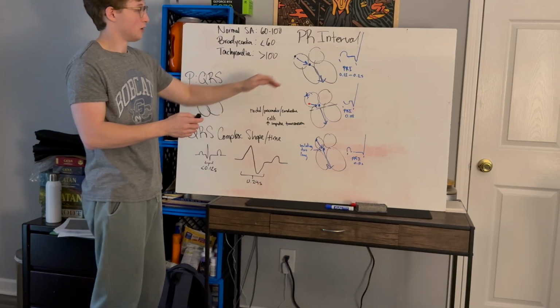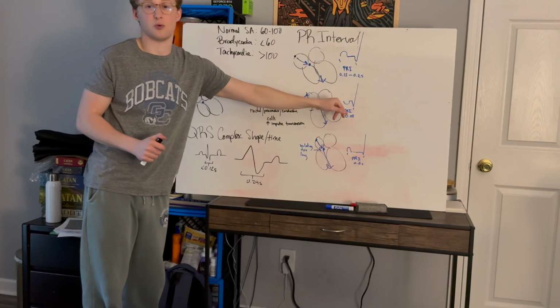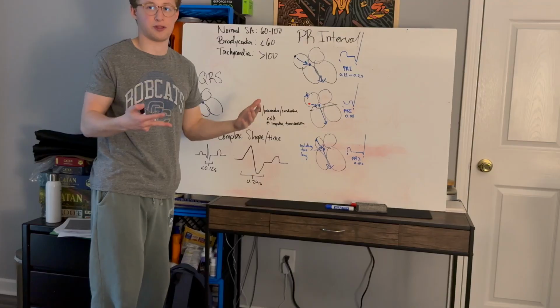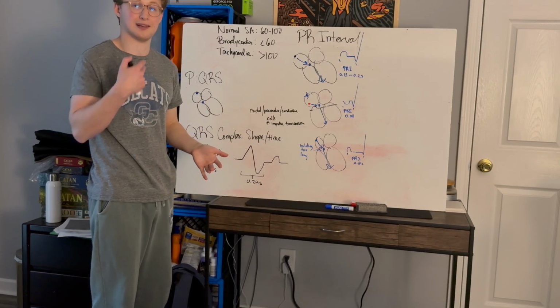PR interval. What does it mean that the PR interval is normal? What does it mean when it's short? And what does that indicate? What do we start to think about? What about when it's long? What do we think about when our PR interval has lengthened?